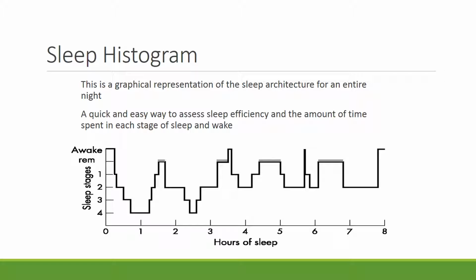And then right at about the 7-hour mark, they go back into stage 2, and they remain there until just before the 8-hour mark.